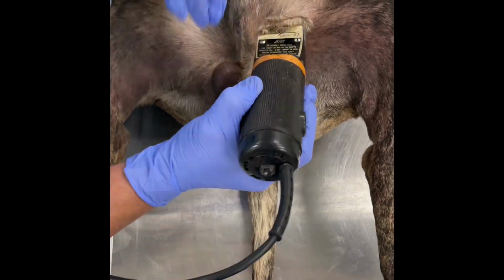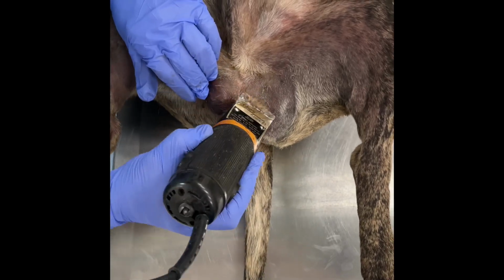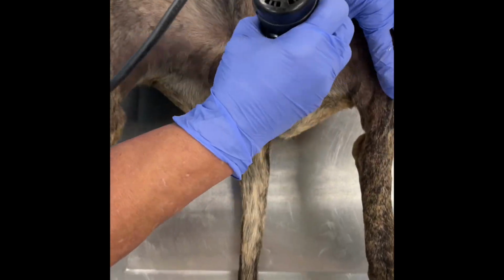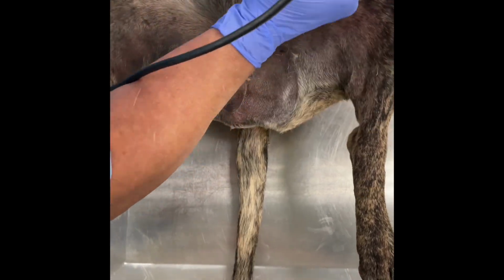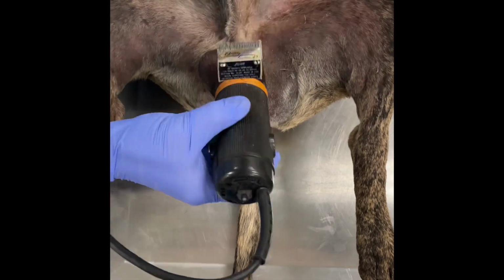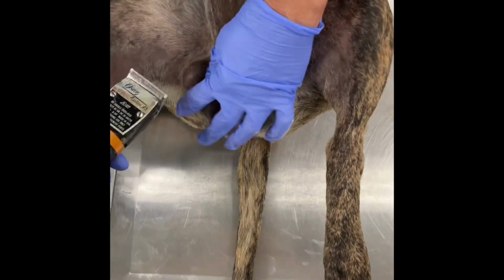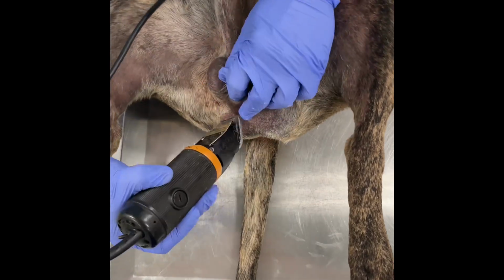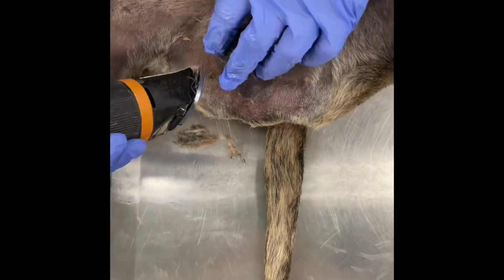So in this class, we are going to shave the scrotum and just below the scrotum for a neuter. Even though this is a pre-scrotal neuter that you'll be doing, a lot of times this will be the first time that you've draped in a neuter. So it's a little easier on everyone involved if the scrotum is fully shaved, so that if you make a small error with your draping, you don't have hair in your sterile field.